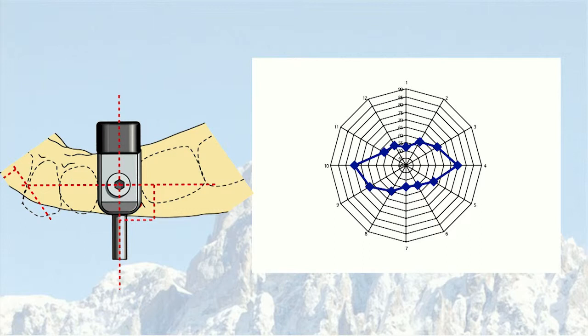And usually the implant is more stable in mesial distal direction since we have more bone to support, and we have less stability in buccolingual direction since often the bone is thinner. And with this technique we actually missed the higher stability in mesial distal direction, and at that time the recommendation was to place the transducer like that.